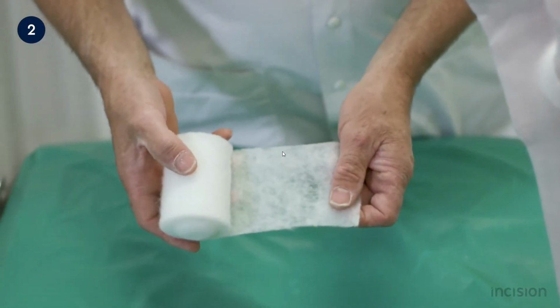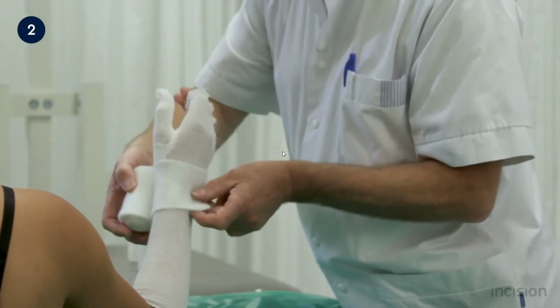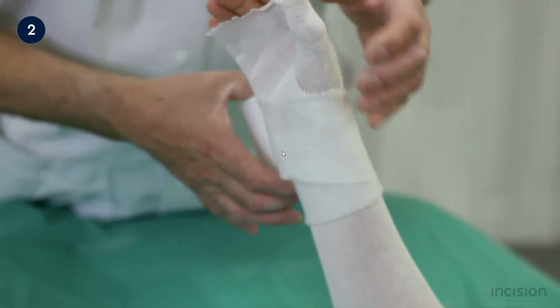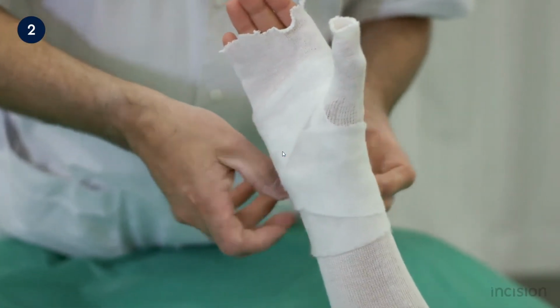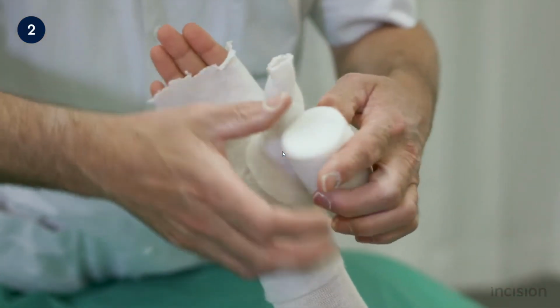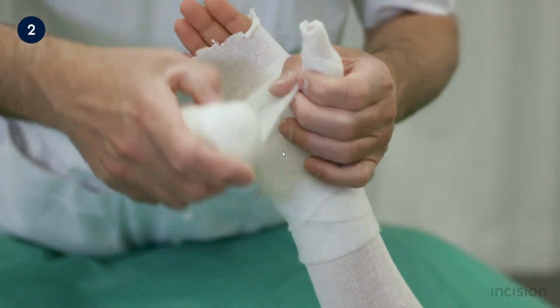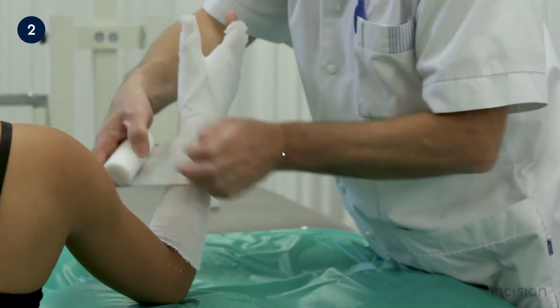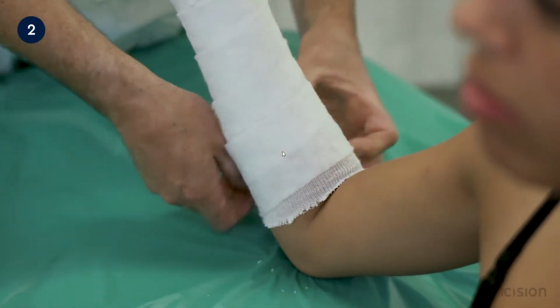The padding is applied so that the flat part is in contact with the limb, allowing easy unrolling. The application is started over the wrist, making sure to include the ulnar prominence. Then through the first web space, over the ulnar side of the hand, around the thumb, again over the ulnar side of the hand, through the first web space, and then the roll is further unrolled proximally. Note that each turn of padding overlaps the previous one by 50%.